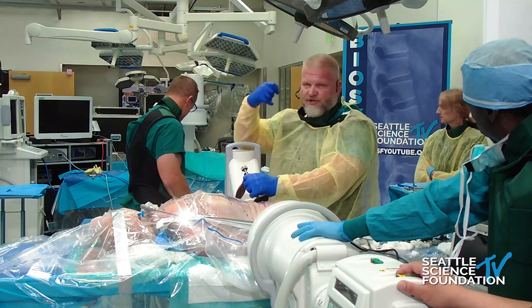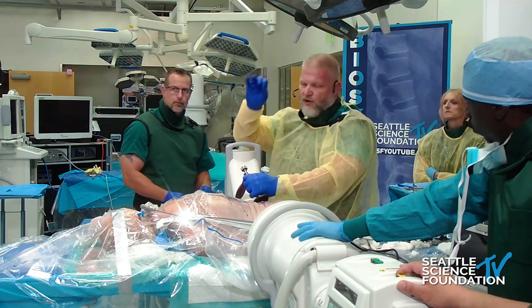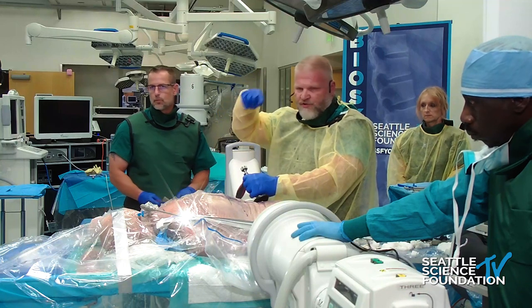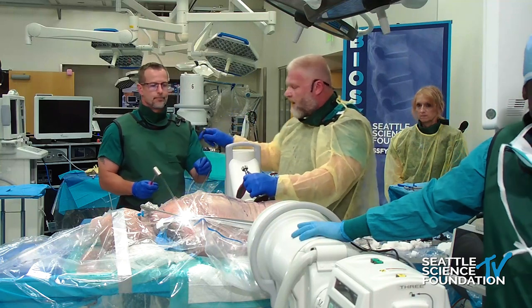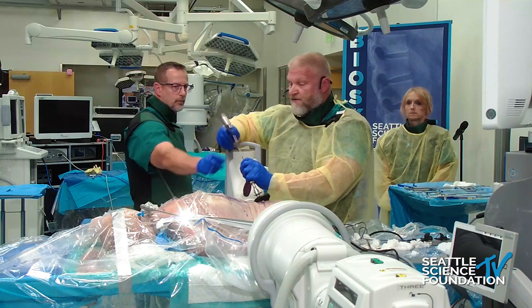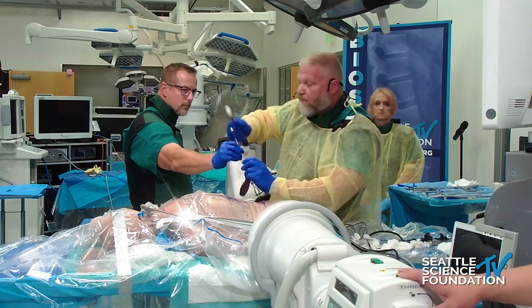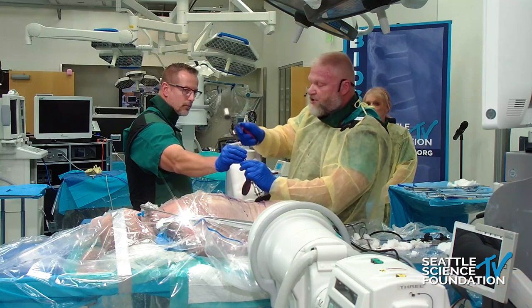And then under direct visualization with a curette is the way I like to do it. I like to just watch it and scrape. If you just rub the end plate, the type 2 cartilage will peel off, and you'll see the compressed cancellous bone underneath. And you'll see in my lecture pictures of what the end plates look like when they're prepped. This system is actually designed to be percutaneous, so they have some nice tools to prep the disc under fluoroscopic visualization.